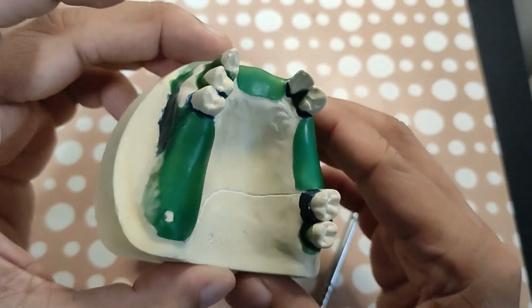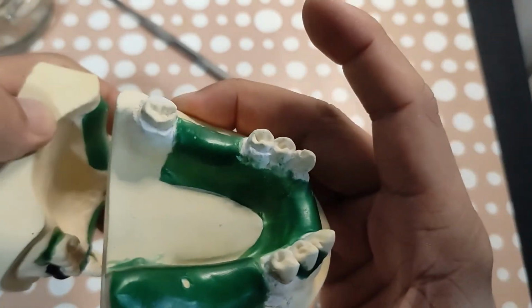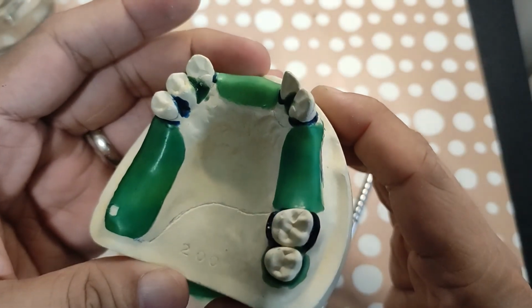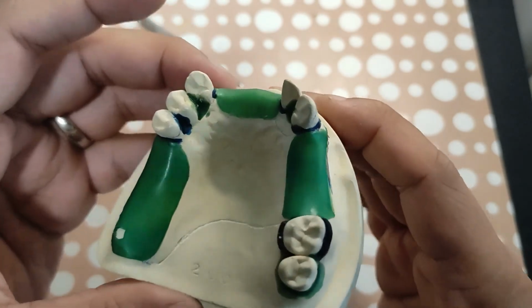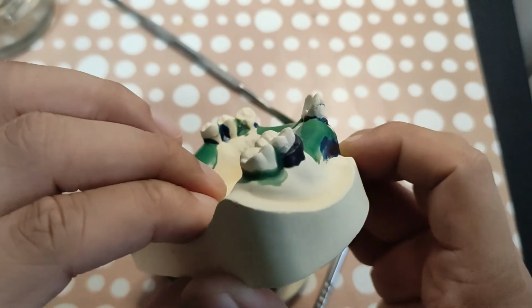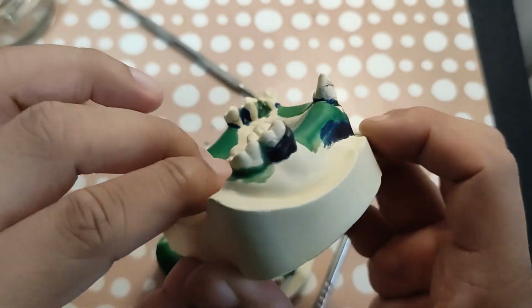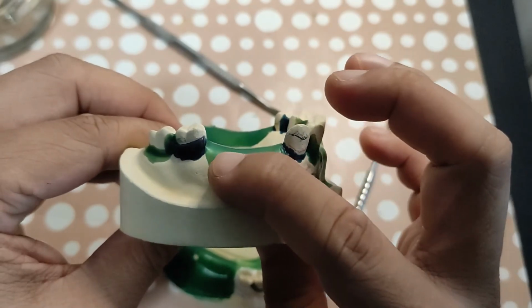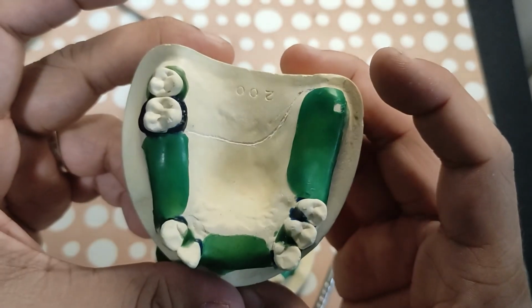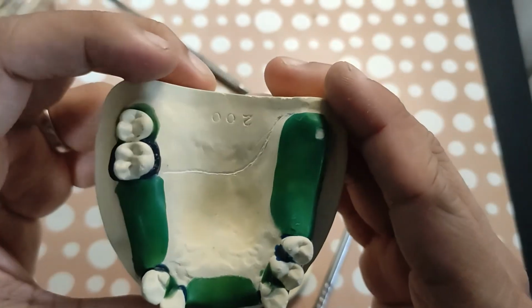For the upper, you see the difference between the two. This one has 2 layers. The upper only has 1 layer of relief. Okay, some arbitrary blockouts again. And this one we used, instead of plaster, we used wax to create shape blockouts and parallel blockouts. Okay, but they're pretty much the same. Acceptable naman siya. There's the scoring here at the middle.